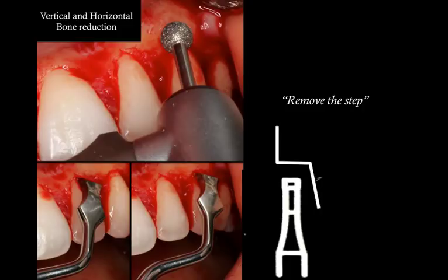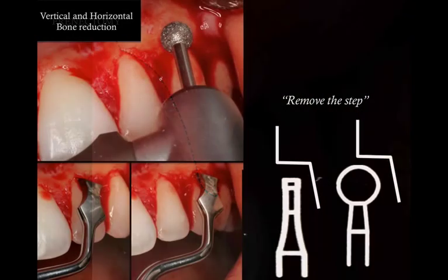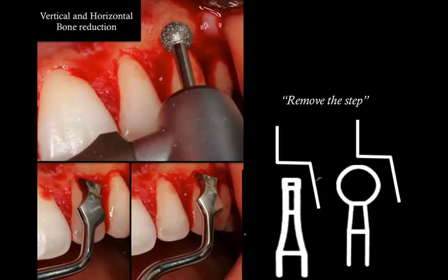So if you're using a crown lengthening burr, an end cutting burr, you'll notice that a step is being created. So what you can do then, either with a round diamond burr or with hand instruments, is basically smooth out this step and remove it very carefully. Be very cautious not to touch the root surfaces, because you may cause some problems in that regard. So once you're done with the bone reduction, use a lot of saline irrigation. There is going to be a lot of debris and things under the flap that you need to irrigate. And that's pretty much the end of the aesthetic crown lengthening.